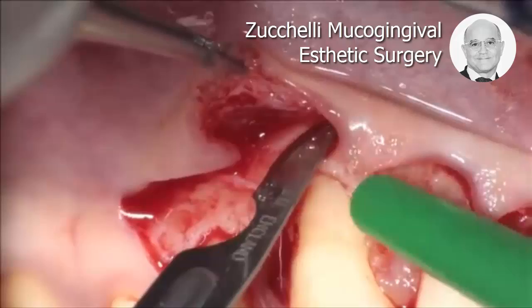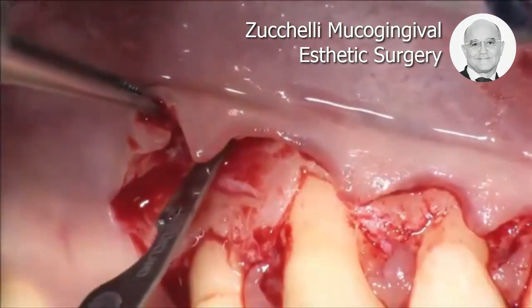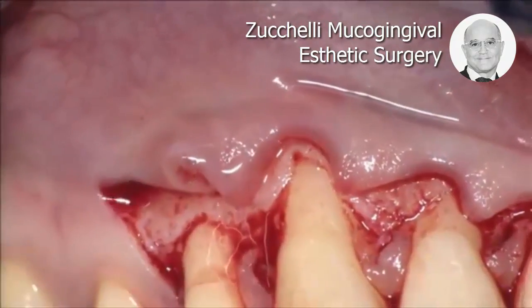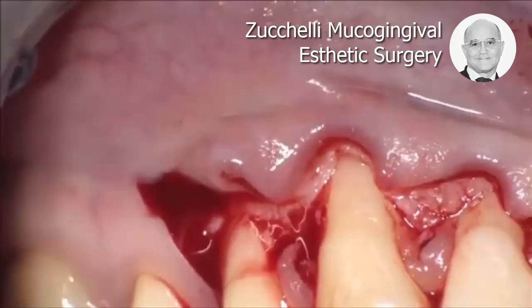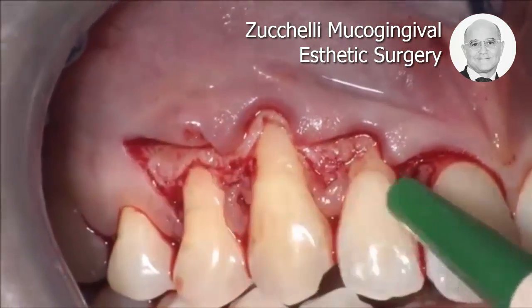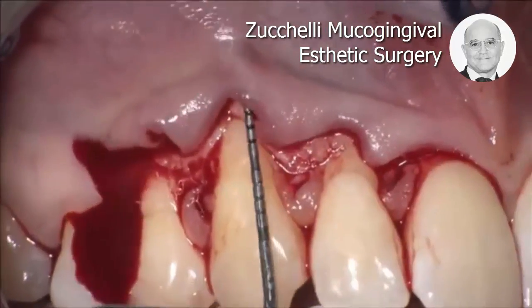Now, parallel to the bone, and only the periosteum is left above the bone. Once this deep incision has been performed, I can use the probe to go parallel to the lining mucosa.